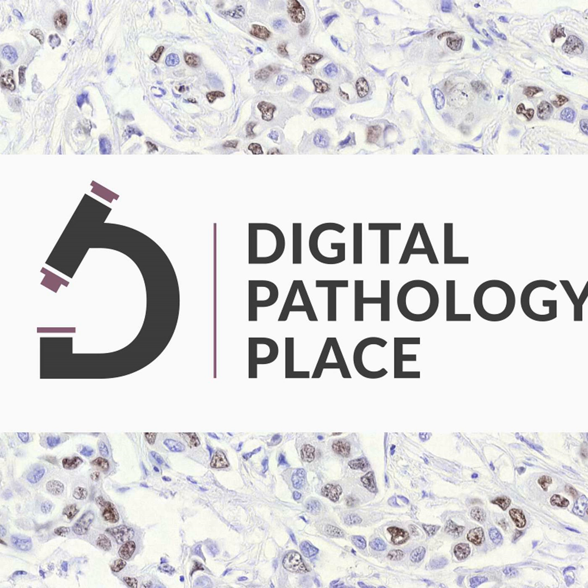The routinely used ones that you probably see all the time are ER, PR, HER2, mismatch repair proteins (MMR), PD-L1, Ki-67, but they also include androgen receptors, PTEN, cytokeratins, uroplakin-2, nectin-4, and immune checkpoint proteins. And then they also examine early evidence indicating associations between the machine learning derived metrics and clinical outcomes, which is what we want to have with these tests.